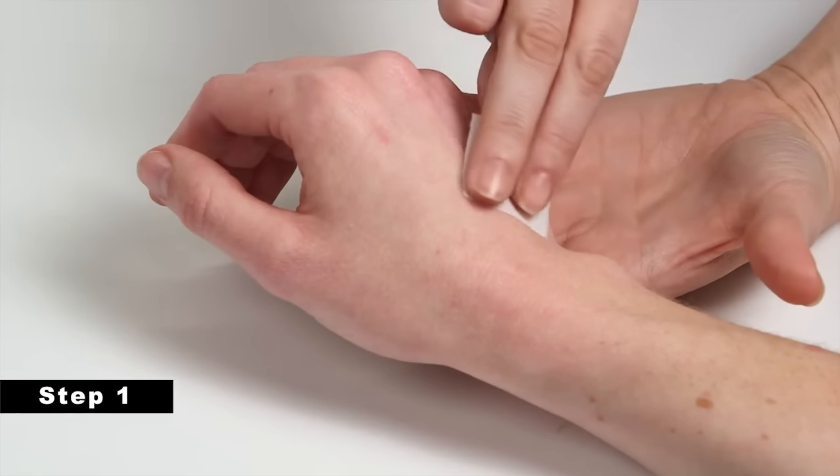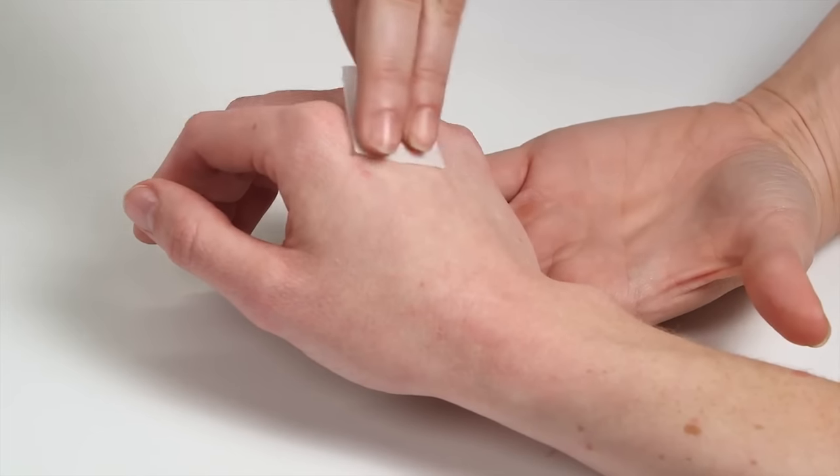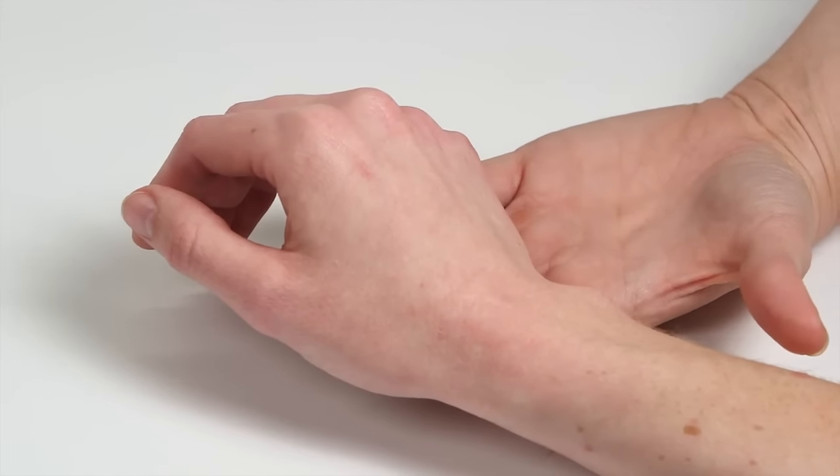Step 1. Select the appropriate injection site and then disinfect the area, allowing it to dry completely. Any residual disinfectant on the skin may cause some discomfort and or a stinging sensation during the procedure.